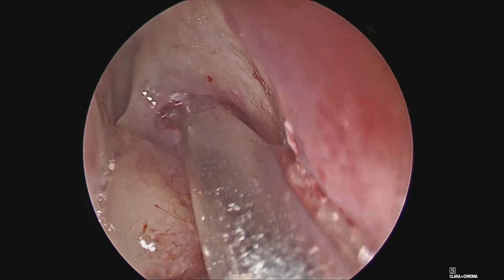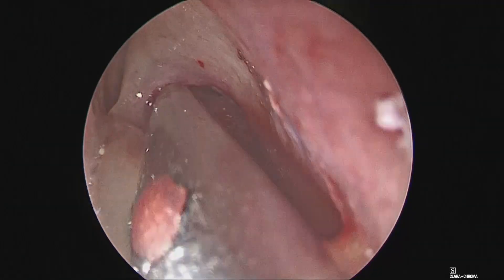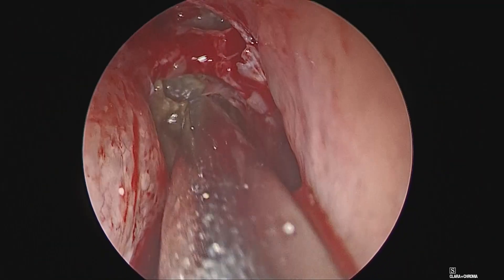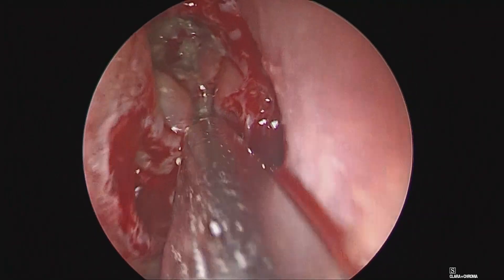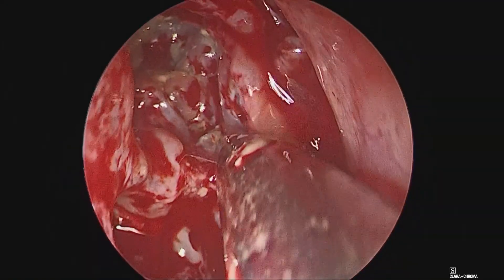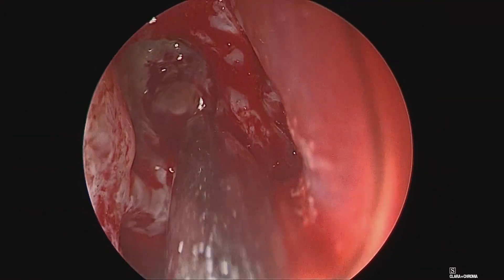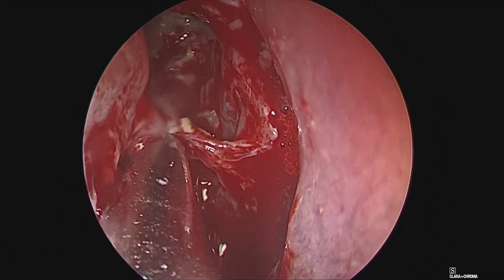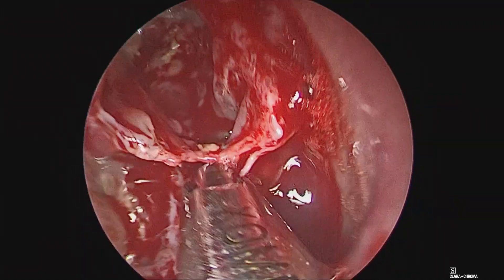We are carefully not violating the middle turbinate and making effort to maintain it till the very end as an important landmark. We first grossly address the polyp disease as well as the fungal component. This part initially is a little oozy and bleeds, which is expected. The most important point here is to constantly irrigate the nasal cavity to keep the scope from getting soiled, avoiding repeated ingress and egress of the scope and minimizing time wastage.